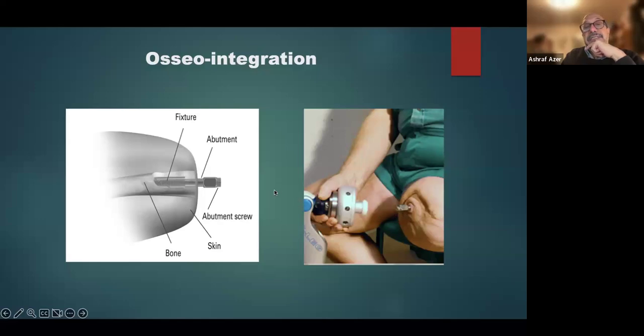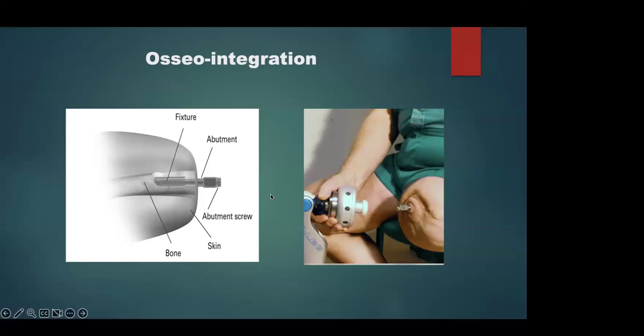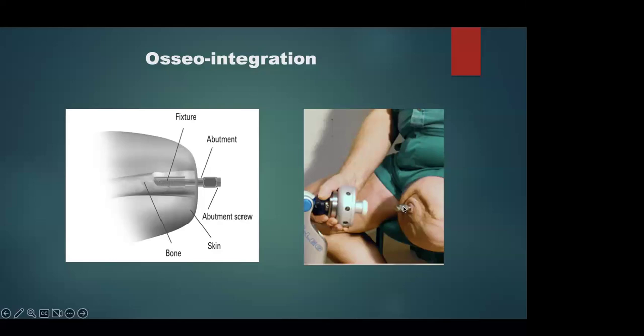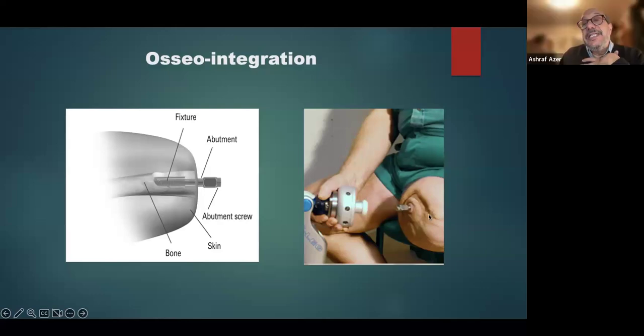So what will happen? What is the main drawback in this? You know it very well. I'm sure you're going to tell me. Infection. Absolutely. Infection or loosening. And what will happen if you have infection or loosening, even if you have pus coming out of here? He won't be able to wear even a traditional conventional socket.